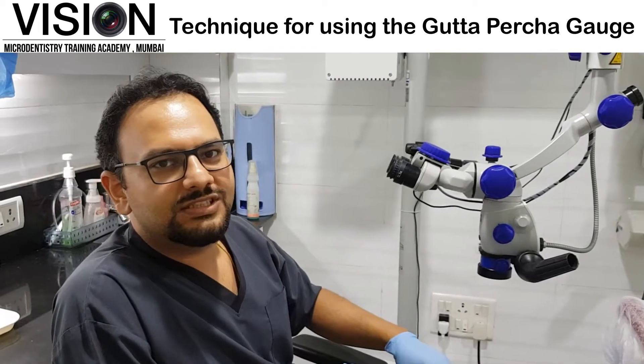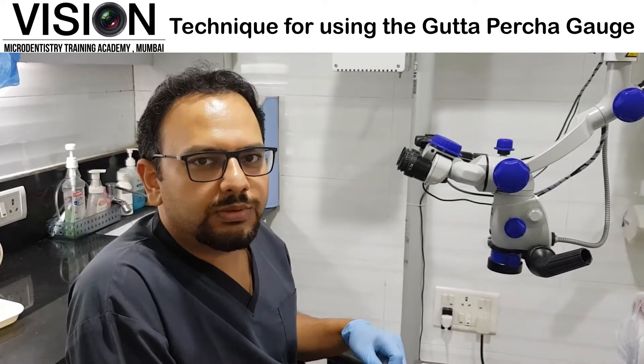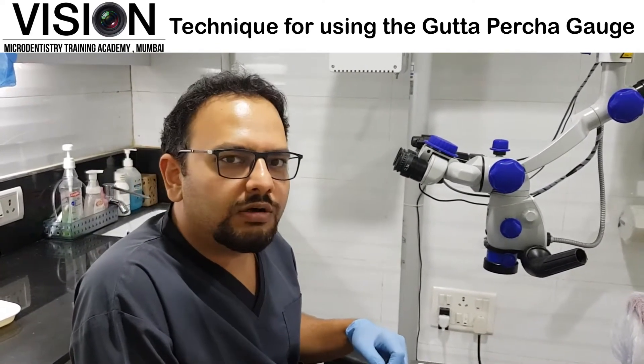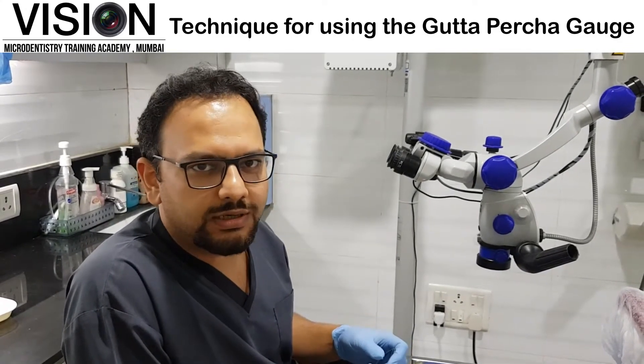Hello friends, this is just a short video to explain how you are supposed to use a Gutta Percha gauge. Before I start talking about the gauge, let me first tell you about the different Gutta Percha points that are available.